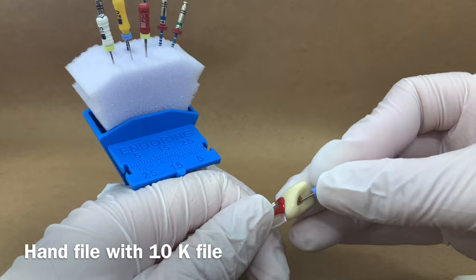Starting with a size 10K file, slowly explore the canal using the quarter turn in and pull motion until it reaches the working length.